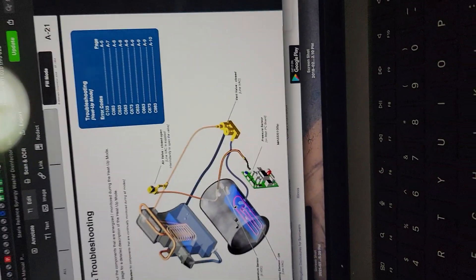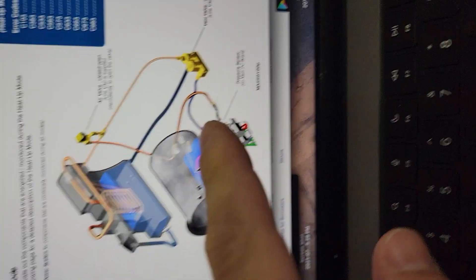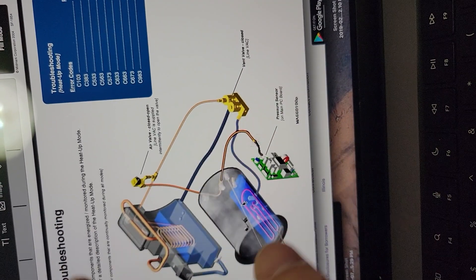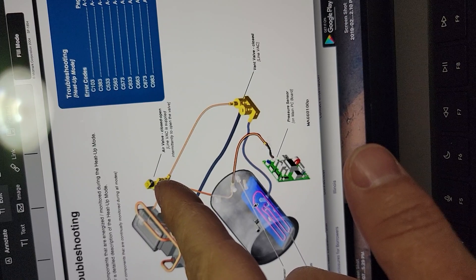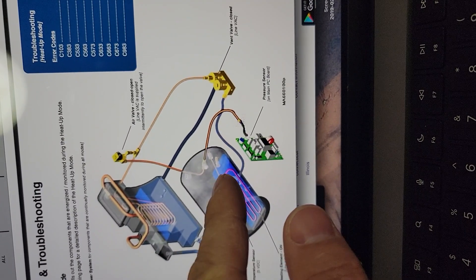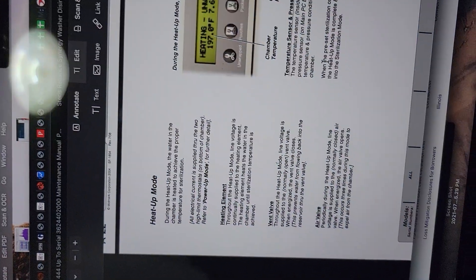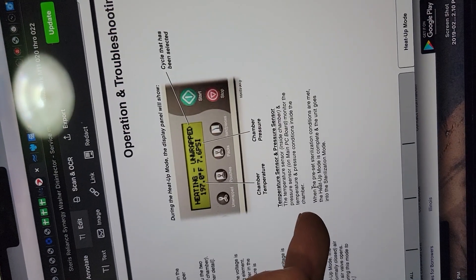Here's the service manual — Mid-Mark has nice diagrams showing everything involved. This is heat-up mode. Here's your reservoir, condensing coil, air outlet solenoid, vent valve, and fill valve. Fill valve is not used during heat-up — it's closed. The vent valve is getting power to stay closed because it's a normally open solenoid. The air vent solenoid is intermittently open and closed. There's your main board, pressure sensor on the board, heating element, water in the chamber, and temperature sensor.